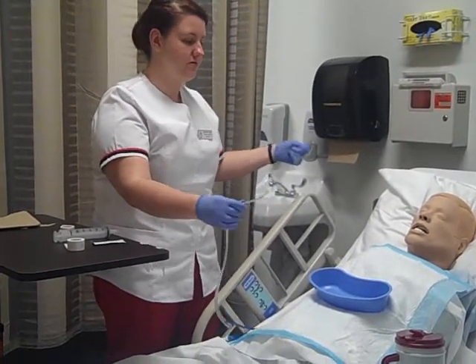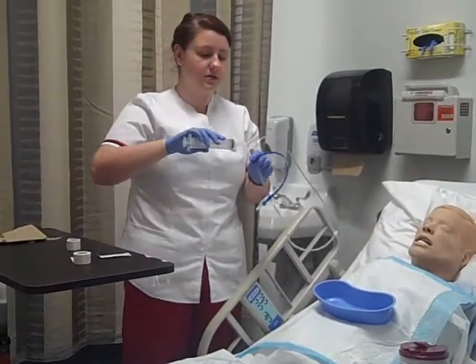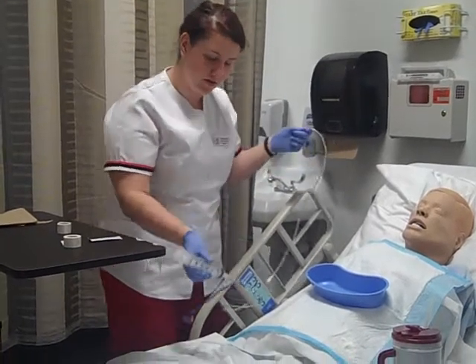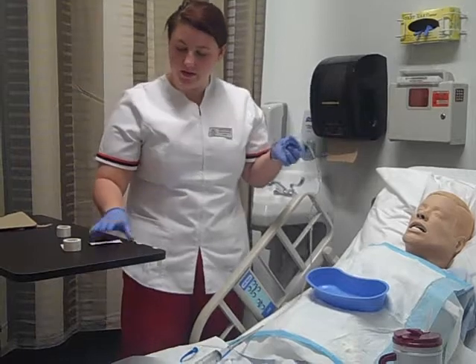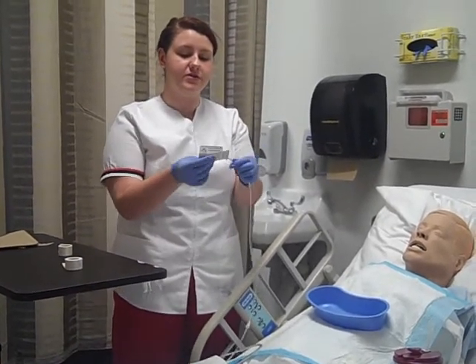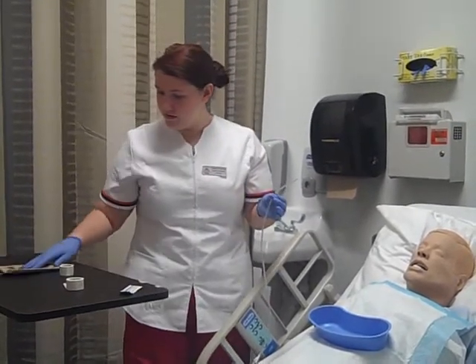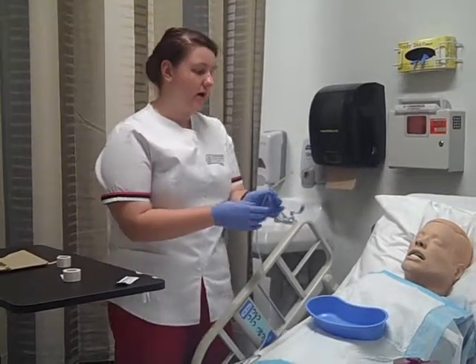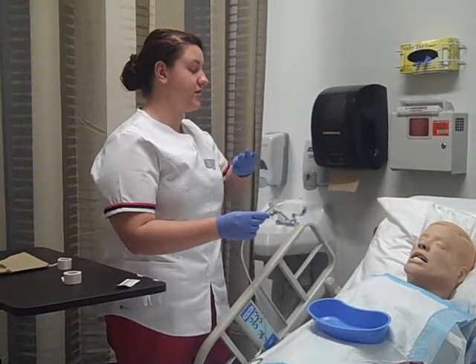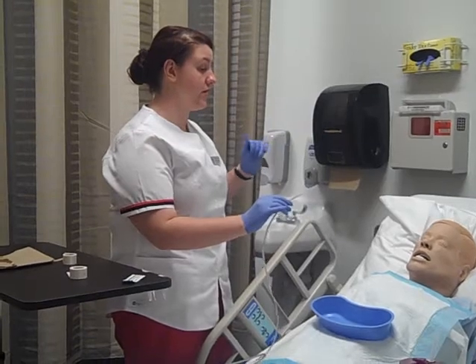Okay, just making it more flexible. I have that there. I'm going to clamp my syringe. And I'm going to lube the tip of the NG tube. Okay, Miss Amy, I need you to lean your head back, and I'm going to insert the NG tube up your right nostril.